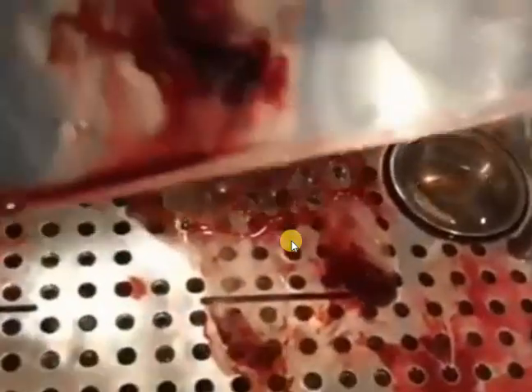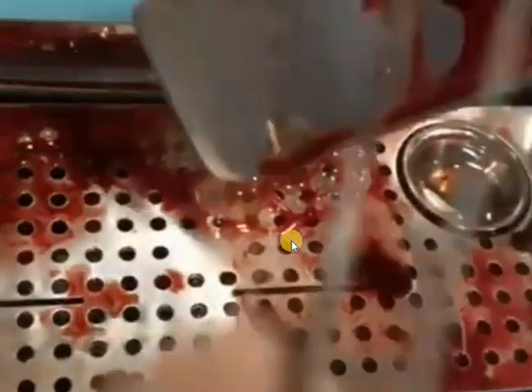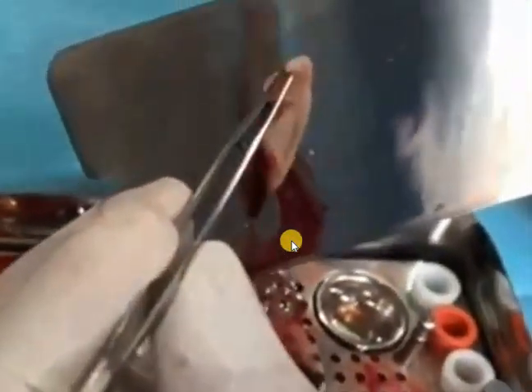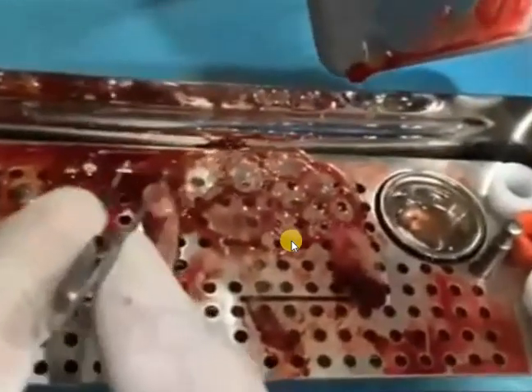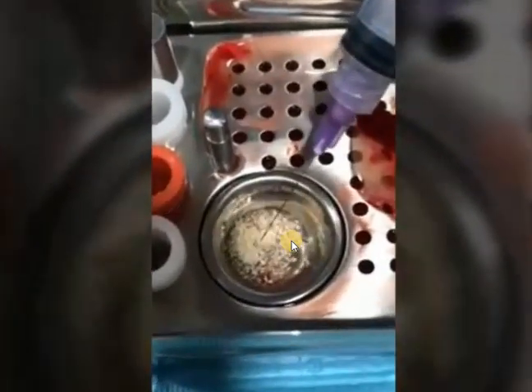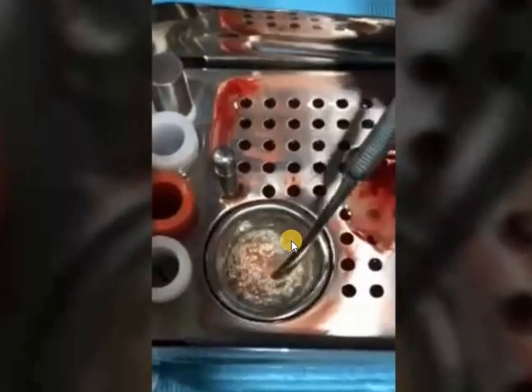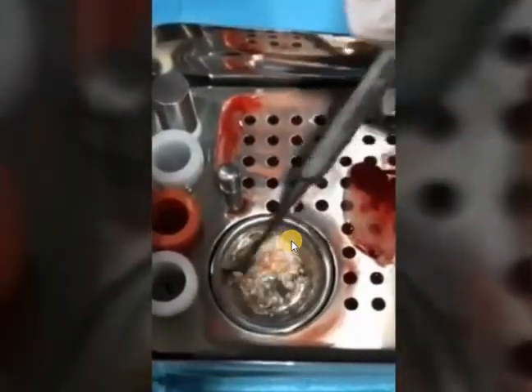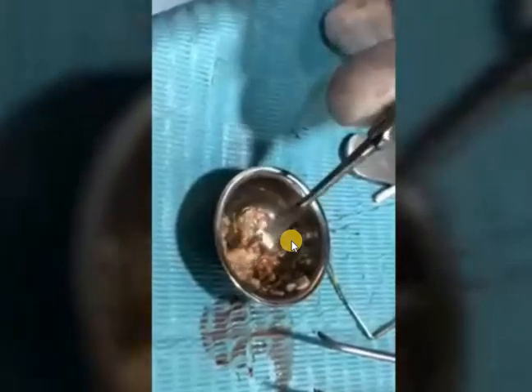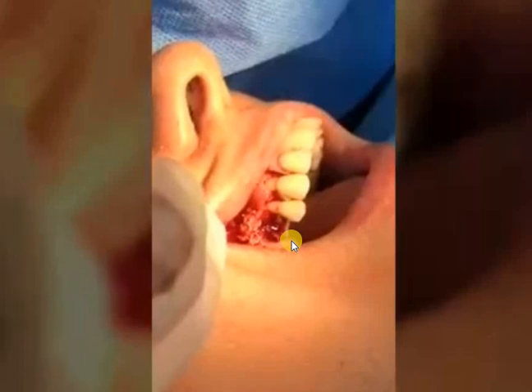When we uncover the metal cover, we will see the membrane separated from the plasma. We separate the plasma using a syringe and mix it with the bone to get a stickier bone mixture and enhance regeneration, since it is the patient's own plasma.